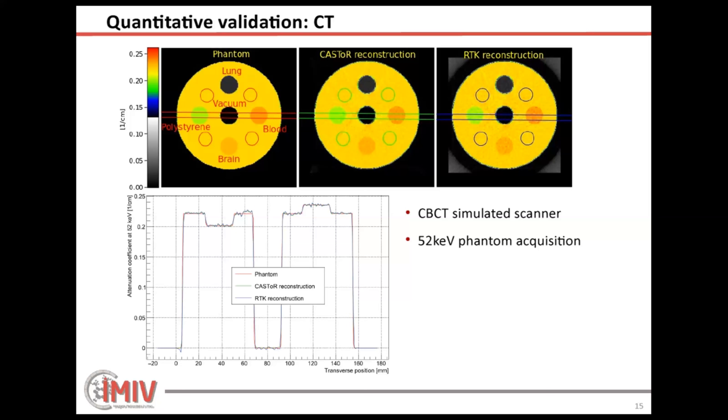Any other questions from online? Not at all. You mean, obviously if the phantom just leaves the cone, we have some problems, but as it is iterative, we just do nothing about it. But in this case, the phantom was inside the cone, but not in the extreme extent. There were obviously some artifacts in the extreme slices.